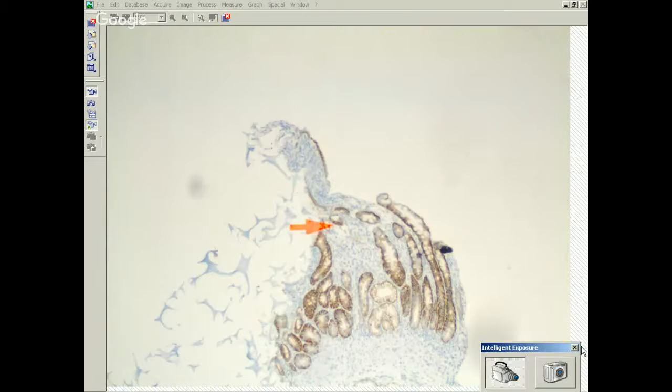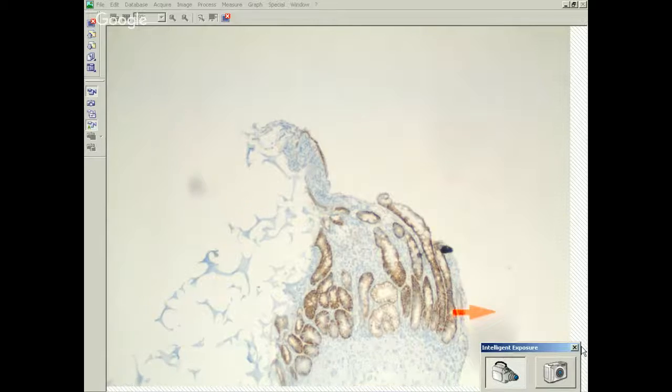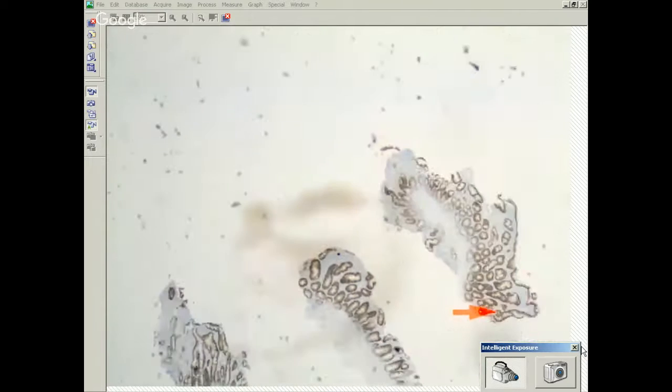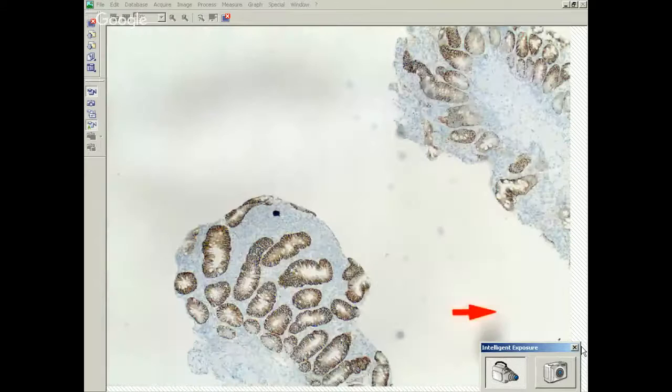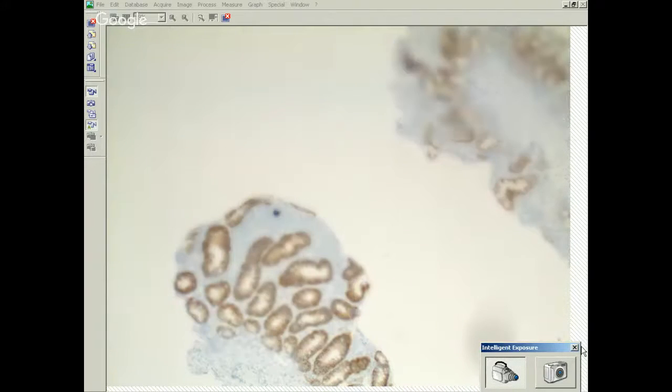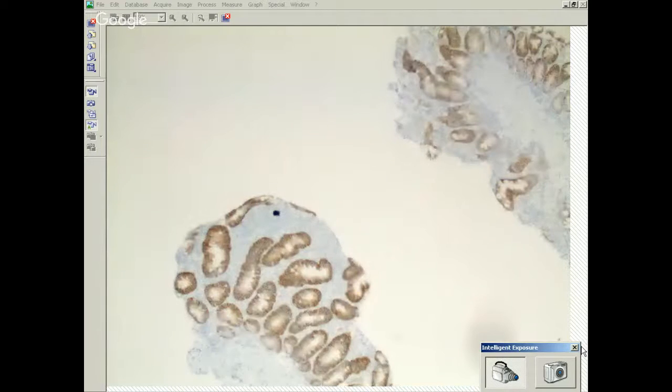In normal duodenum, the lamina propria is full of plasma cells, really full of plasma cells. But here, there's actually none, see? It's completely clean, completely vacant. So this is really unusual for duodenum, and it's pretty much diagnostic for CVID.